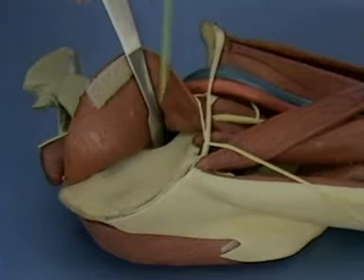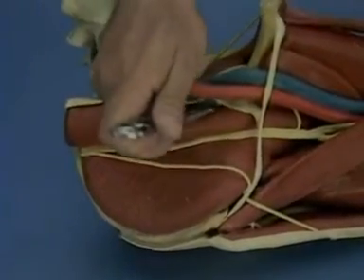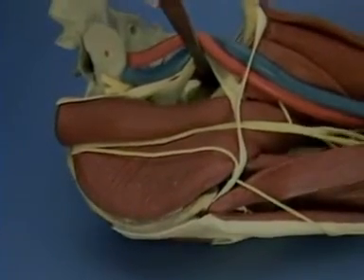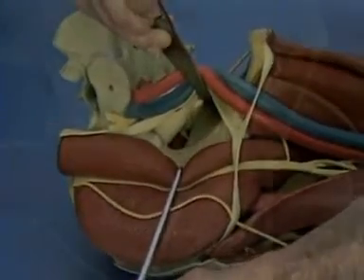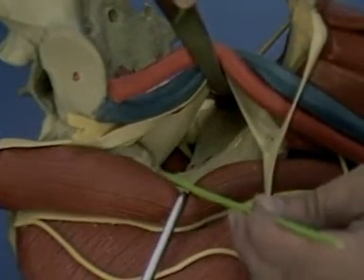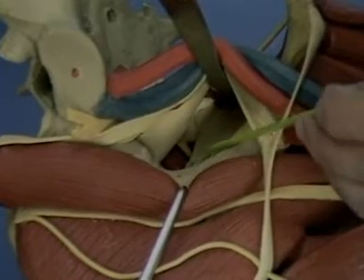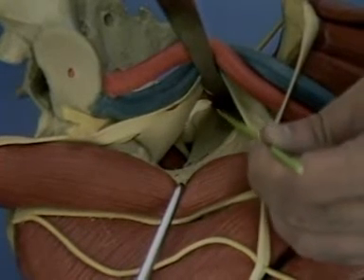To create the second window of the ilioinguinal approach, the femoral vessels are retracted medially. The iliopectineal fascia is detached from the pelvic brim, and the obturator internus is elevated from the quadrilateral surface. The iliopsoas and femoral nerve are retracted laterally. Through the second window, we have exposure of the pelvic brim from the anterior sacroiliac joint to the superior pubic ramus. The quadrilateral surface is visualized with a retractor placed with the tip near the ischial spine.